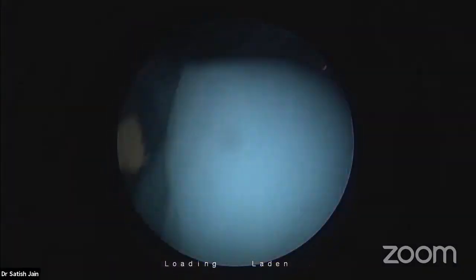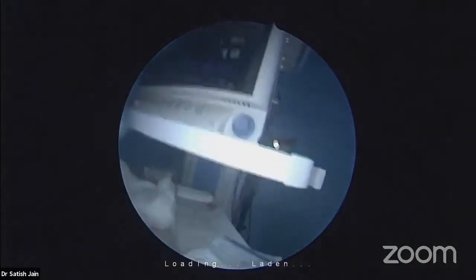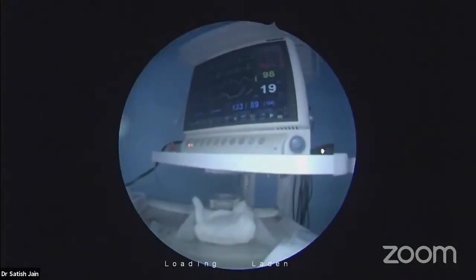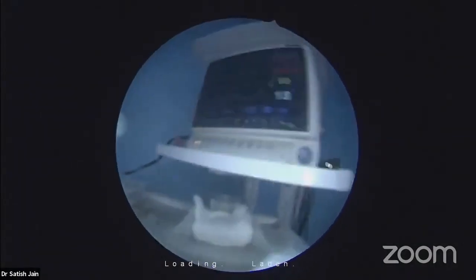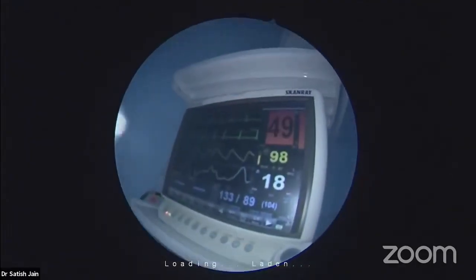Yes. So, our patient, let me tell you, our monitor. I tell you, we never believe in hypotensive anesthesia. Always normotensive. We don't want to put our patient under risk. See this. If you see our monitor, our blood pressure is 133/89. Can you see? Mean blood pressure 104. No question of hypotensive, but look at the pulse.